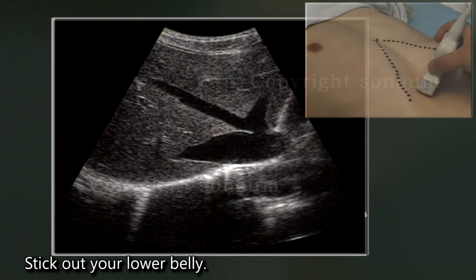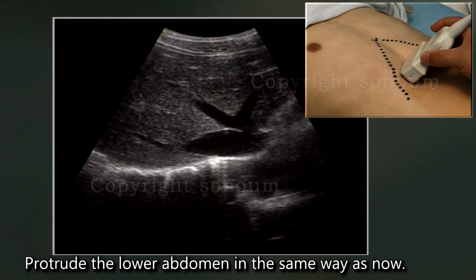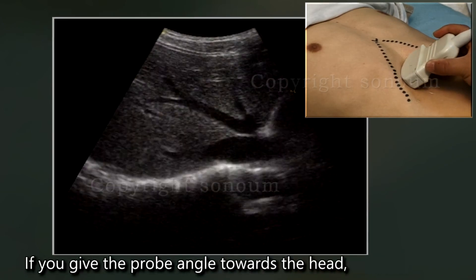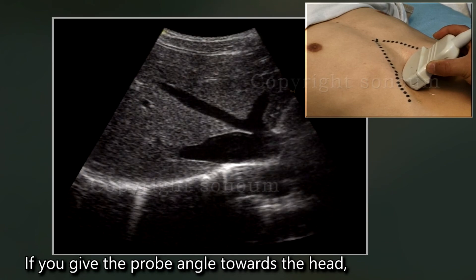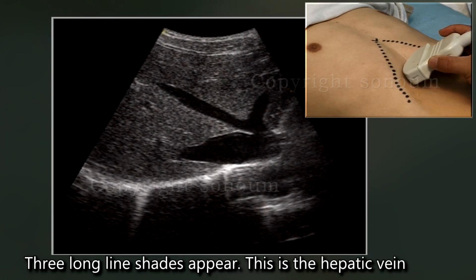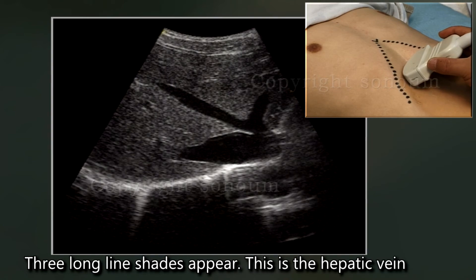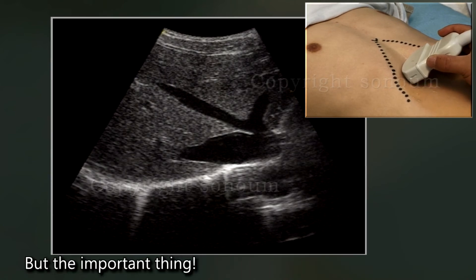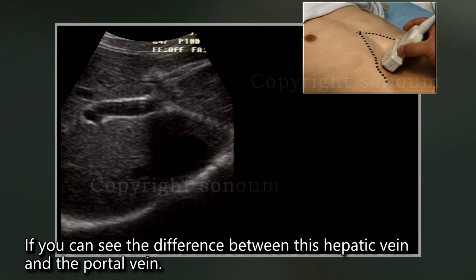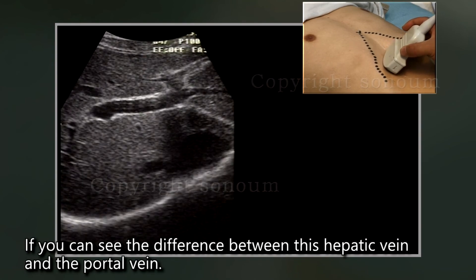Look again. Stick out your lower belly — protrude the lower abdomen in the same way as now. If you give the probe angle towards the head, three long line shades appear. This is the hepatic vein. The important thing is whether you can see the difference between this hepatic vein and the portal vein.